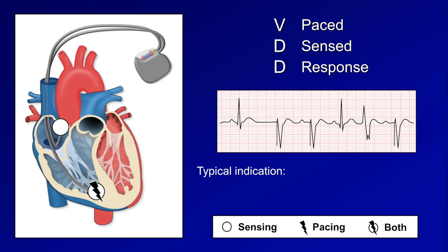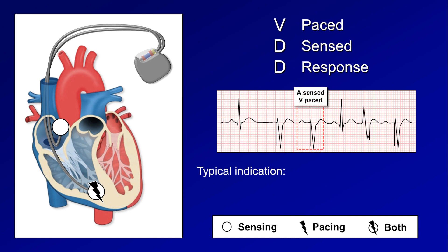In VDD mode, the ventricle is the only chamber paced, but the device senses from both the atria and the ventricle. We can see an A-sensed V-sensed beat where the pacemaker detects normal intrinsic conduction. An A-sensed V-paced beat occurs when the patient's sinus node depolarizes normally, giving a normal P wave, but because of AV block it's not followed by a normal QRS complex within a set period of time, resulting in a ventricular pacing spike followed by an unusual paced QRS. This is considered a triggered response since the timing of the ventricular spike was determined by sensing of the previous P wave.